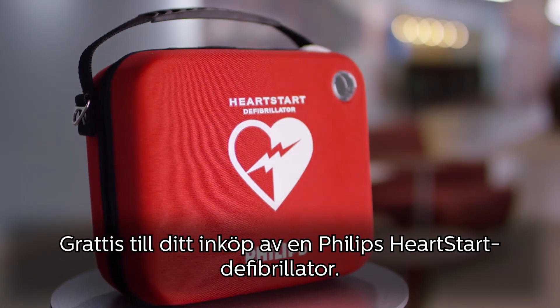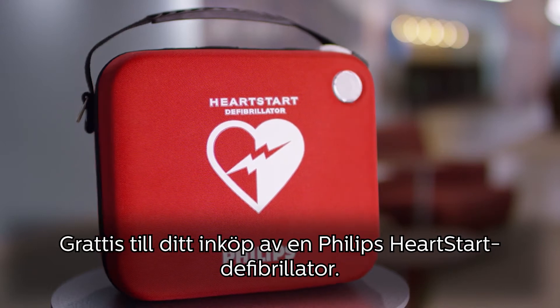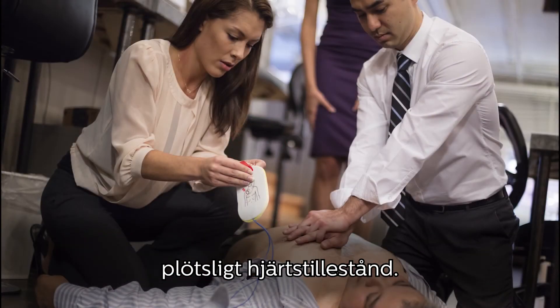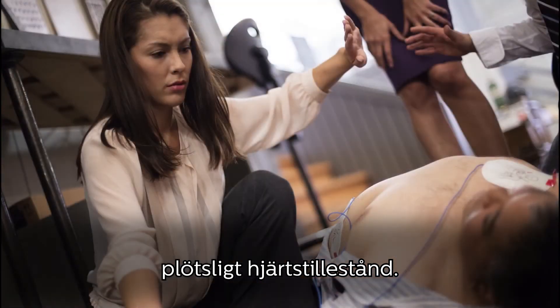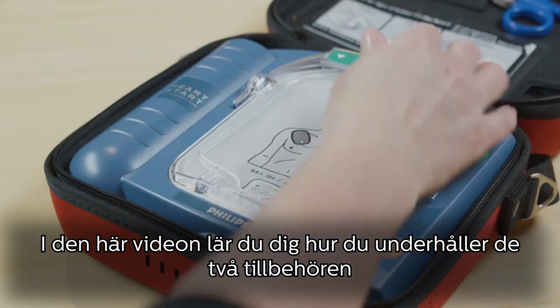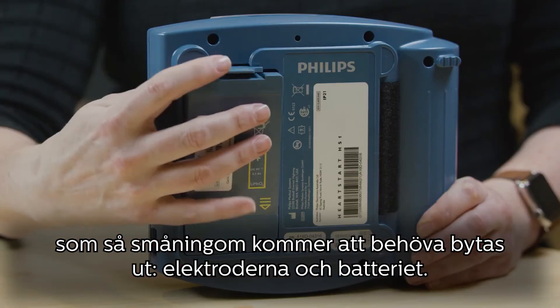Congratulations on your purchase of a Philips HeartStart defibrillator. Your HeartStart AED can help you save the life of someone suffering sudden cardiac arrest. In this video, you will learn how to maintain the two accessories that will eventually need to be replaced: the pads and the battery.